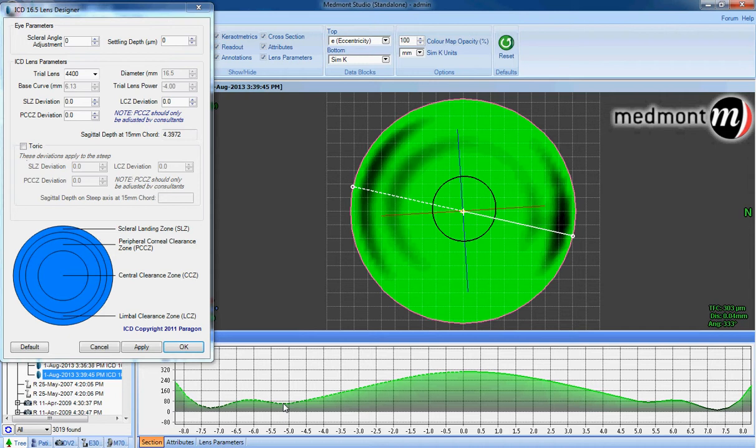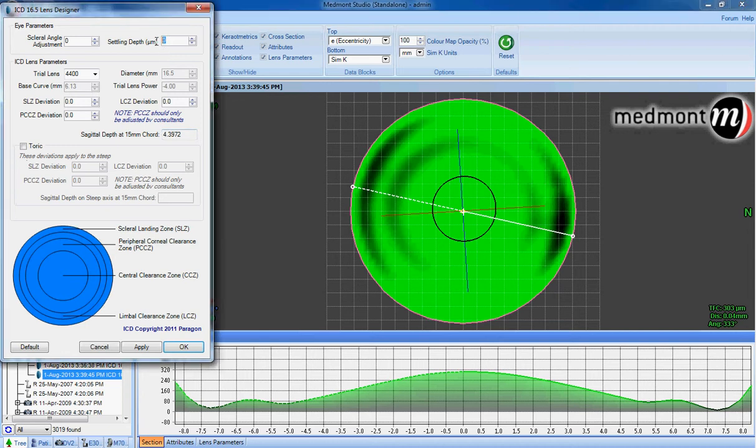This allows for very little settling of the lens into the boggy conjunctiva, and it's typical for the ICD to sink 50 to 250 microns into the soft tissue of the conjunctiva. The average settling is approximately 150 microns.